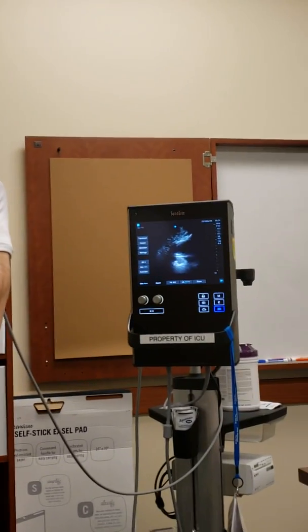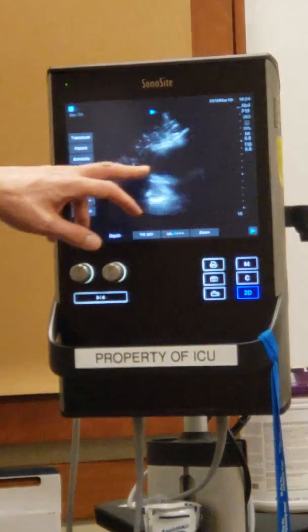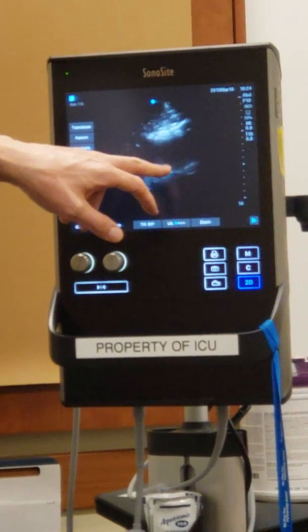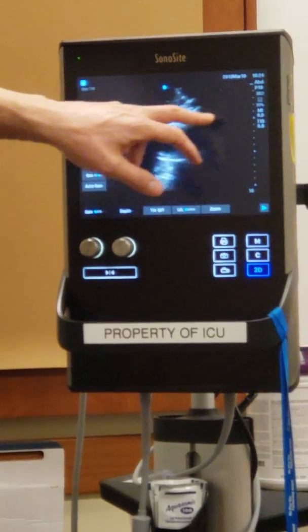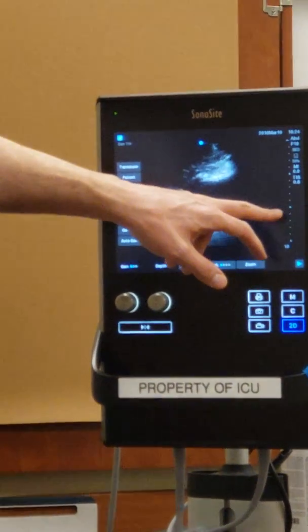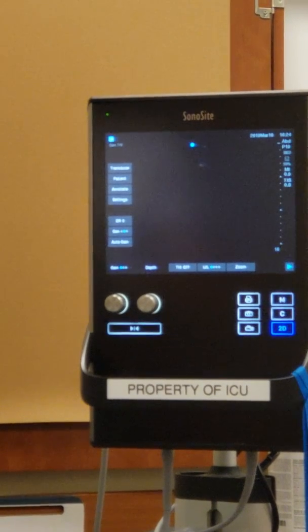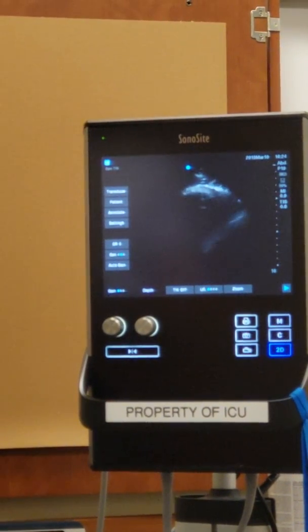There — you can see something beating. It's not the image I want; it's somewhat of a short-axis view. You can see my heart beating right there, and you can get an idea of why we want a deeper probe. The heart is about 10 centimeters deep — you wouldn't be able to get this image with the shallow probe. Let me try to get an apical view of my heart.